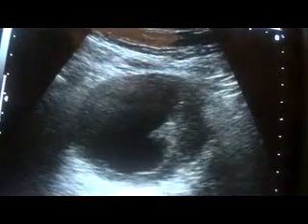Let's now also see the prostate gland once again. This is the prostate in transverse section — separate. This is the prostate gland with a normal outer surface and no relation with the blood in the urinary bladder.